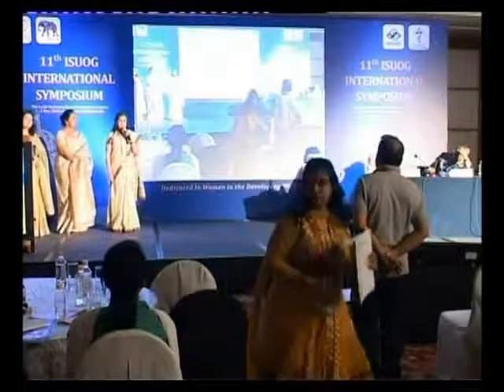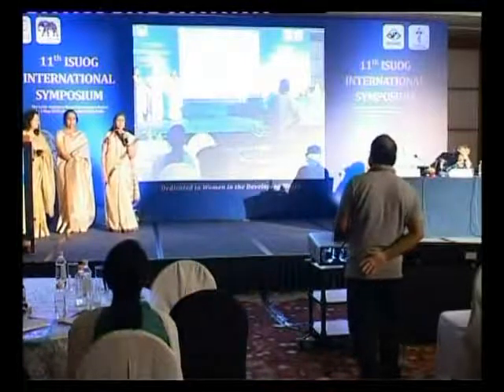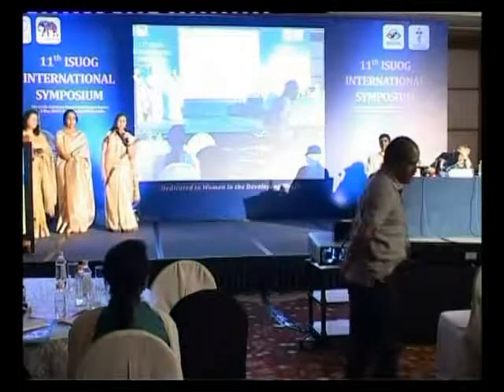So yes, I did not include that. Ovarian ectopic is extremely rare. So first thing is, don't start thinking of ovarian ectopic. The second thing is the corpus luteal walls are always isoechoic to the stroma.